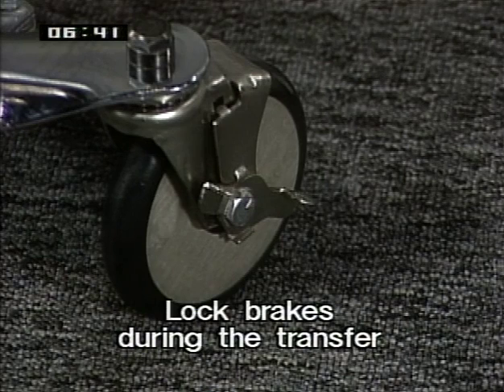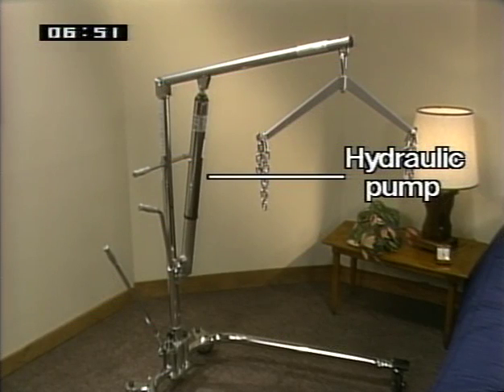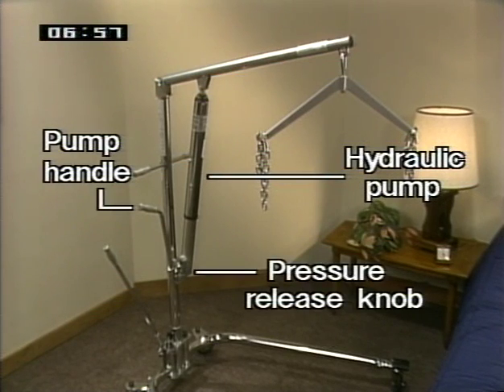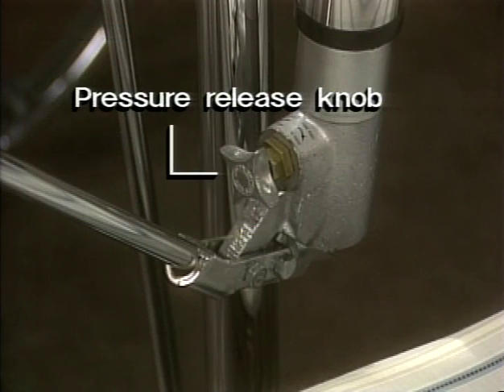If it's necessary to move the lift during the transfer, release the caster brakes, carefully move the lift, and lock the brakes before lowering the patient. The hydraulic pump enables you to move the patient up and down. The pump handle is equipped with a pressure release knob located near the base of the handle. By turning the release knob, pressure is either released or contained, allowing the lifter boom to be raised or lowered.